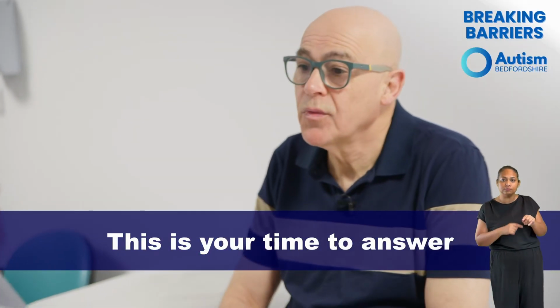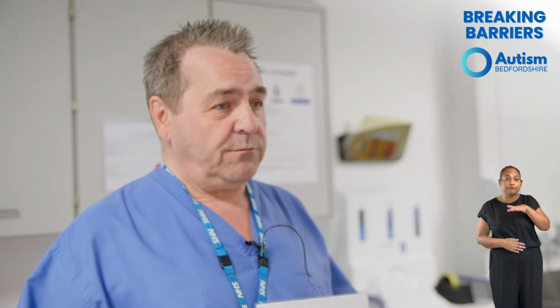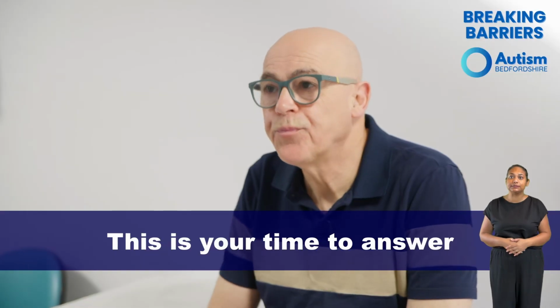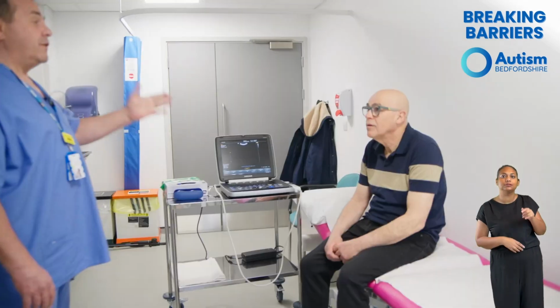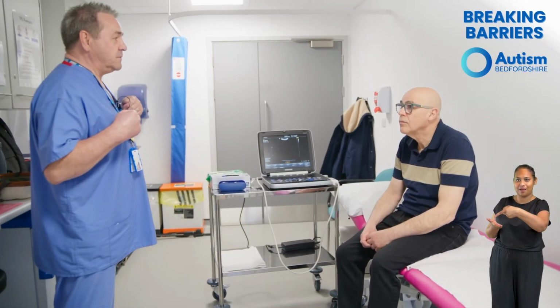No. Okay, I just need to ask you a few questions. Do you know if you have any family history of aneurysms? No. Have you ever had any surgery on your aorta? No. And is it okay if we store and use the data that we're collecting today for research purposes? Yes. Okay, thank you very much. If you'd like to lay down on your back and just lift your t-shirt up to the top of your chest. Okay.